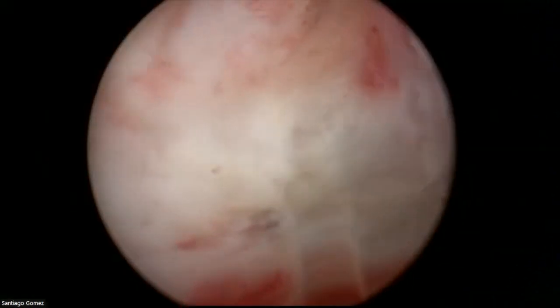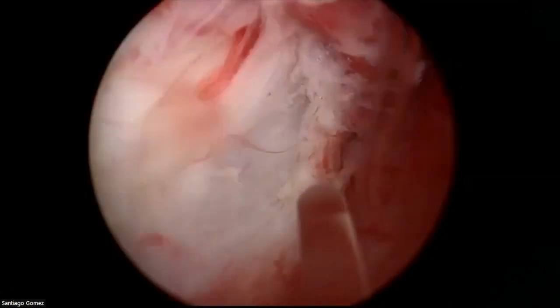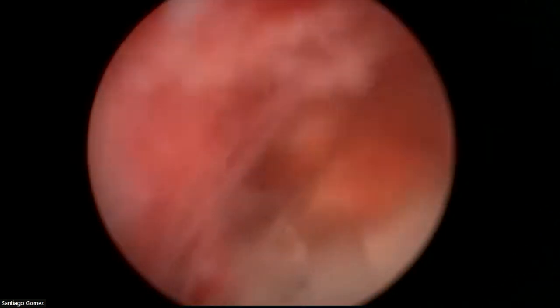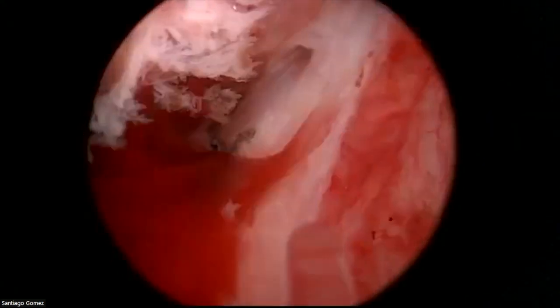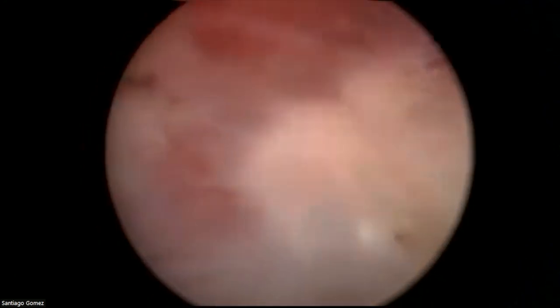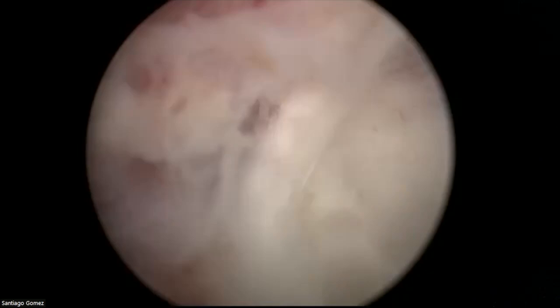You see that we have to go lower because it's common knowledge, or let's say dogma, no? That if you're going to do a resection, you shouldn't go below the veru. But here, of course, we have to look for the anatomical plane. And then I'm going to try to enter the plane. And for that, I'm going to go to the floor of the veromontanum to start developing the plane on this side. This is the right side of the patient.